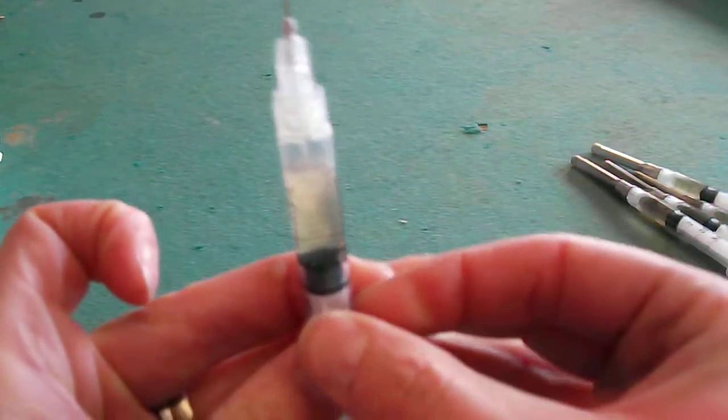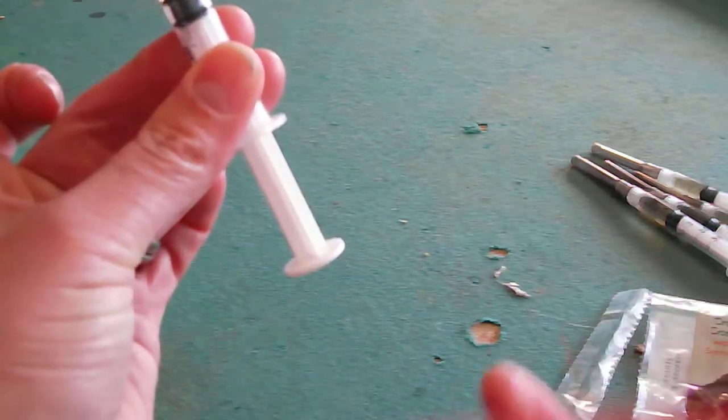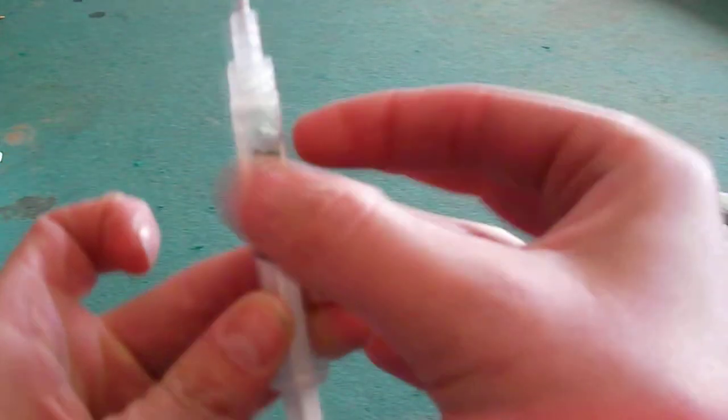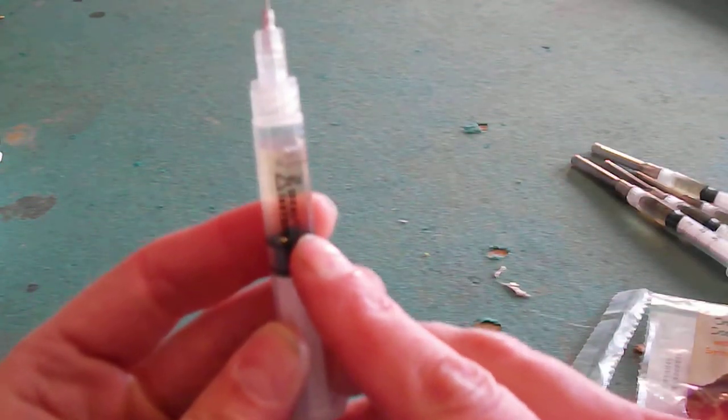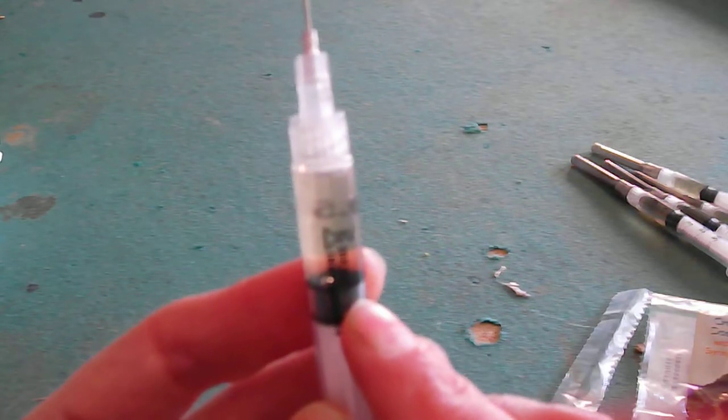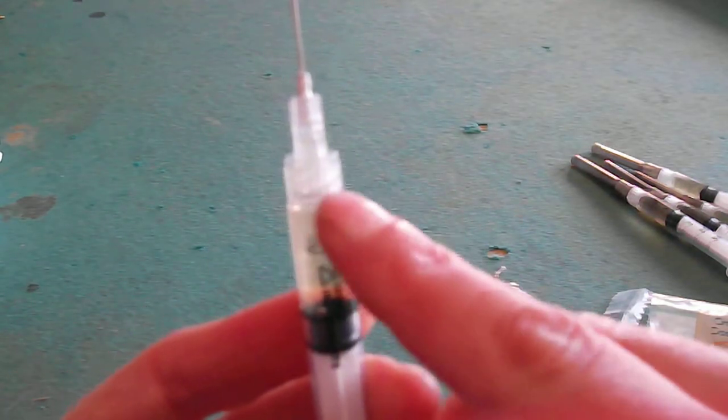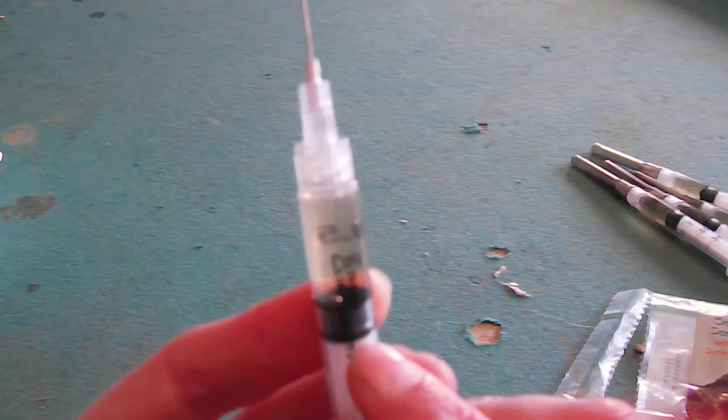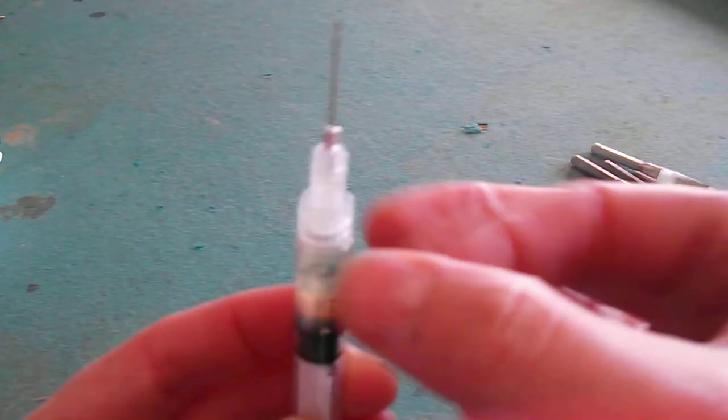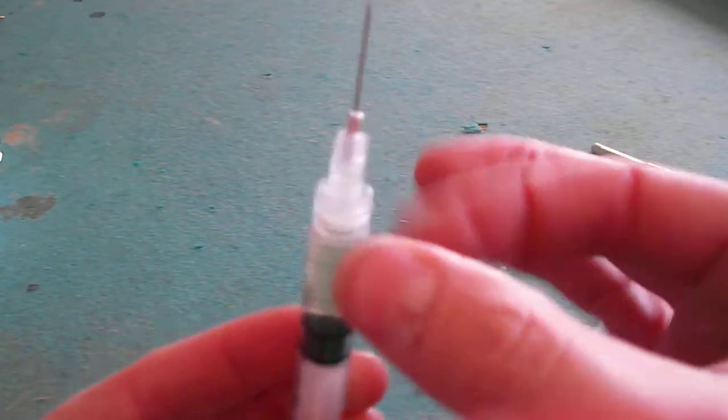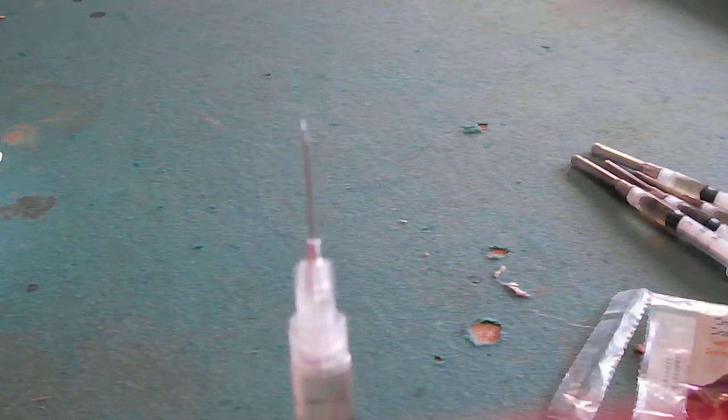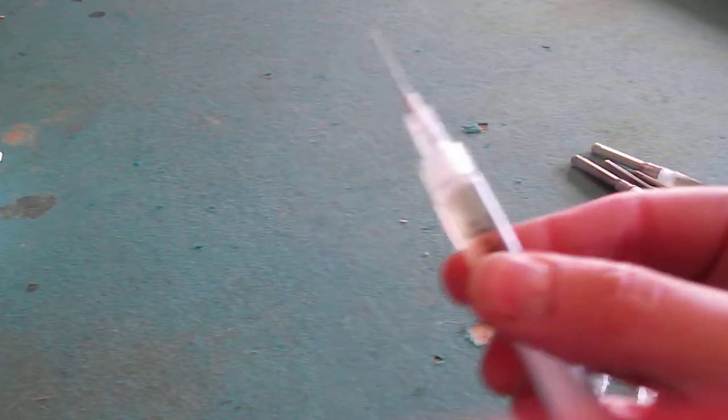Flick it to get the air out before you push this up. Then start pushing the air out. You'll see it start going up into the needle. Stop it for a sec. Flick out the air bubbles again. Give it a little squirt out there. Just a couple drips and you're ready to go.